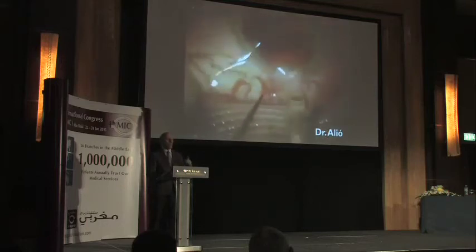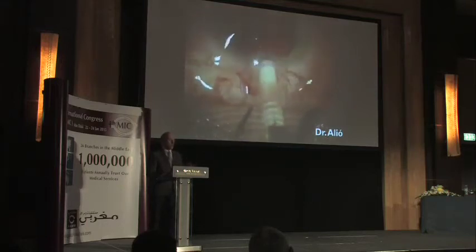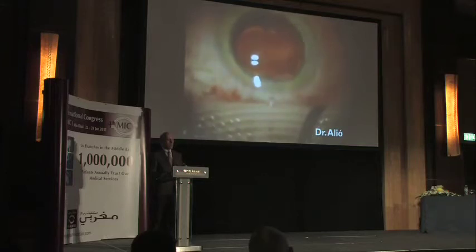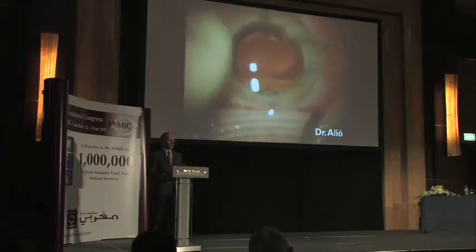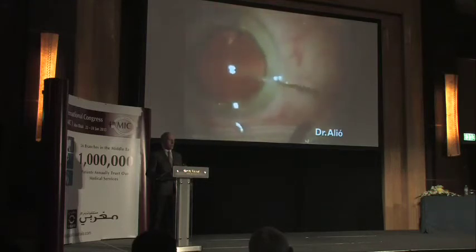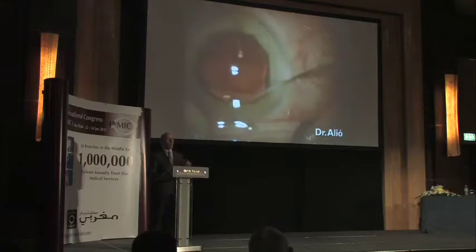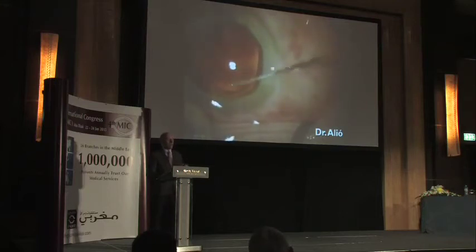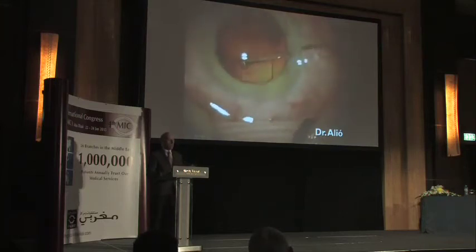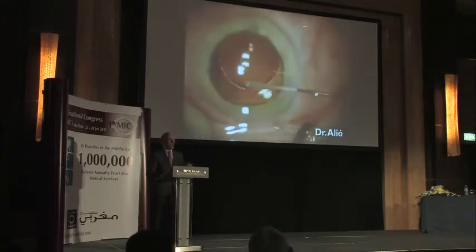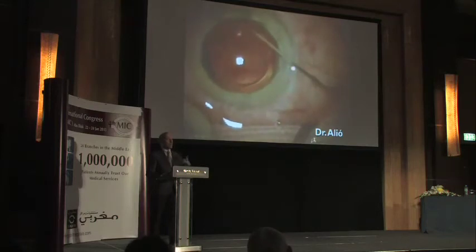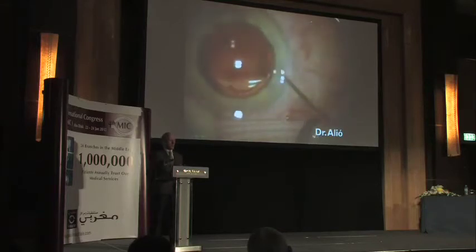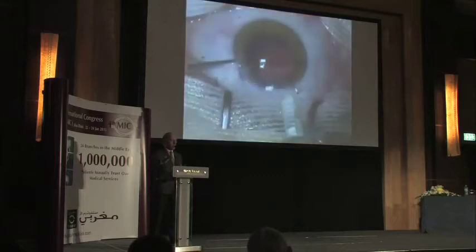This is how I inject the lens, using the tunnel-assist technique, which controls distortion on the incision and lets you control the injection with the second hand — otherwise the lens will not be injected inside the capsular bag. The distal haptic is implanted first, then the trailing haptic is pushed inside the capsular bag. You do not need to rotate this lens at all, because you implant it already on the axis you want. Removing the viscoelastic does not cause lens rotation. It is an extremely elegant lens for micro-incision surgery.